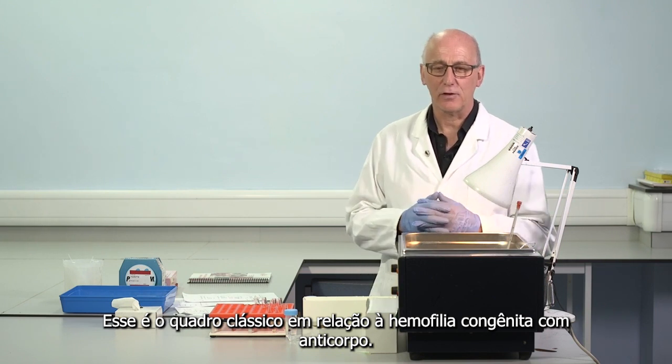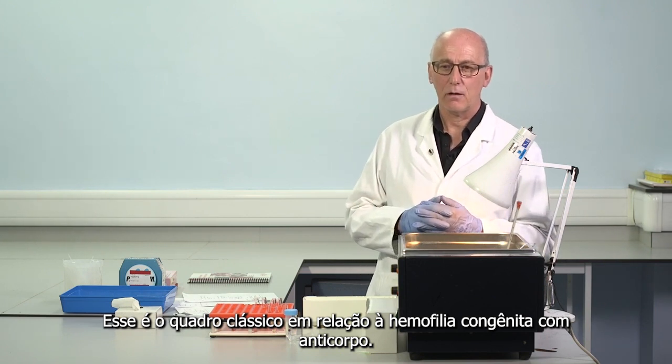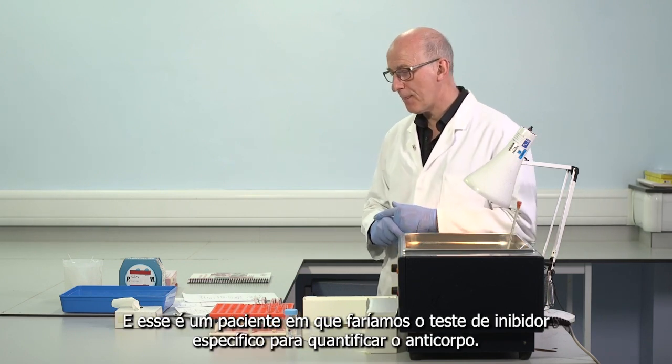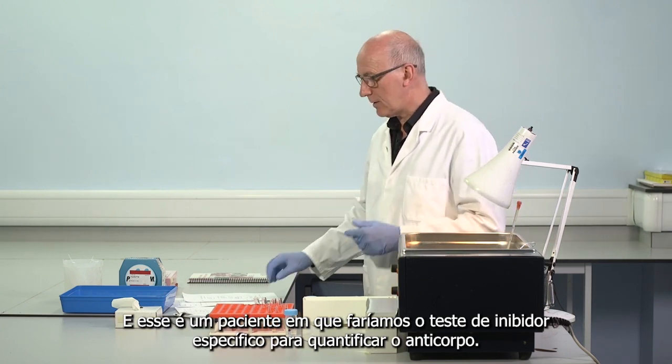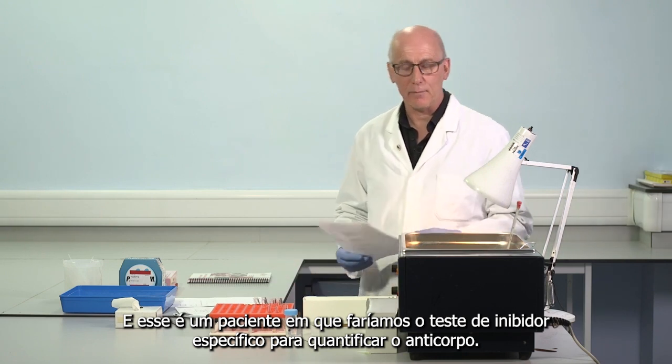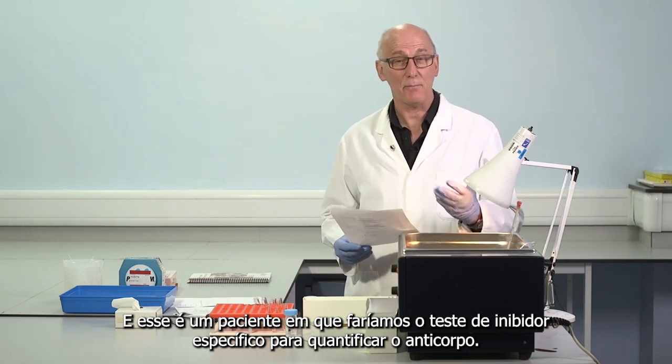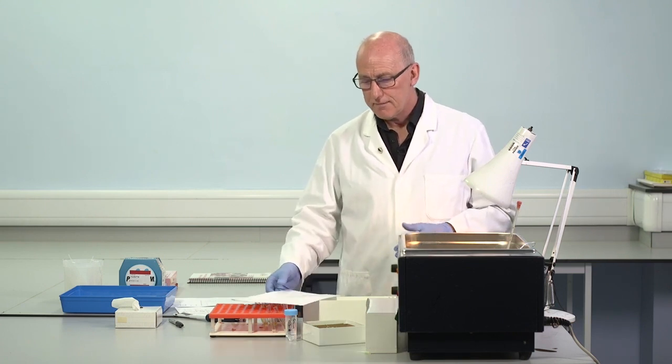That's a classical picture in relation to congenital haemophilia with an antibody. And that's a patient where we would make the specific inhibitor test in order to quantify the antibody. It's important to know the concentration.